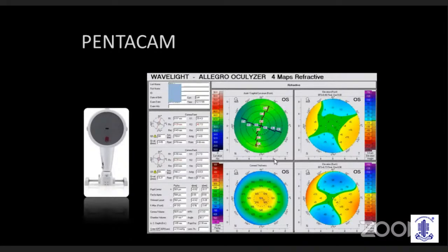The 2 main important things to remember: there is no ocular surface detected. You can't see for the clarity of the Mires in a Scheimpflug image, so it is not going to support you that way. Second thing, in the same case, the simulated K values are taken over the whole corneal value, so this cannot be used in any of our IOL power calculation.